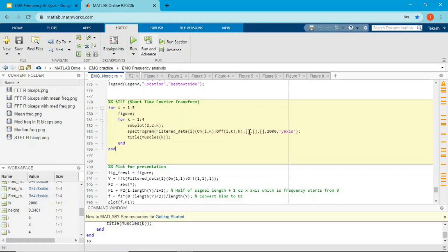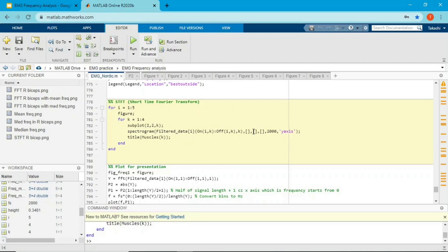The second input argument is the time window — watch other YouTube videos for a good explanation of how FFT windowing works. You can manipulate the time window size here. The third argument is the overlap of the time window. For example, if you want a 1-second window at 2000 Hz sampling rate, put 2000. For half-second overlap, put 1000 — so FFT runs over 1 second, moves half a second, and repeats until the end. The fourth argument controls frequency resolution.